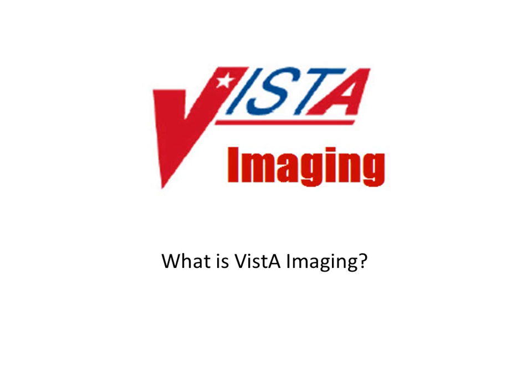Vista Imaging is designed to provide the treating physician with a complete view of patient data and at the same time allowing consultant physicians to have access to the image and text data, whether in the same department, in different medical services, or at different sites. Vista Imaging is unique in that management of the medical images is handled by the Hospital Information System, allowing very close integration of multimedia data with traditional patient chart information.